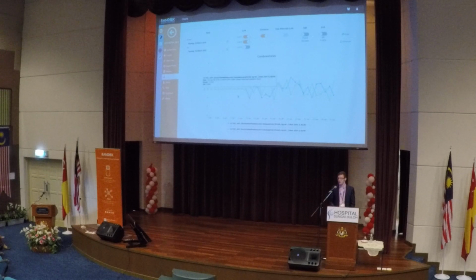So in this case, the target that we are using to compare against is a cumulative target that is calculated based on the QC results that we upload. So it takes 20 results for us to upload before it will assign our QC target and ranges. So that's why these first 20 results here are just straight on the mean, because our software has been calculating, and then from this point onwards it has assigned a mean and we're being compared against that. So we can see on the left hand side on the y-axis we have our SDI. So this is fixed at a rate from +3 SDI to -3 SDI.